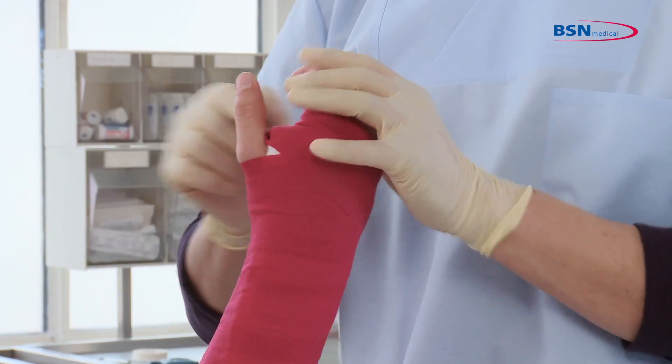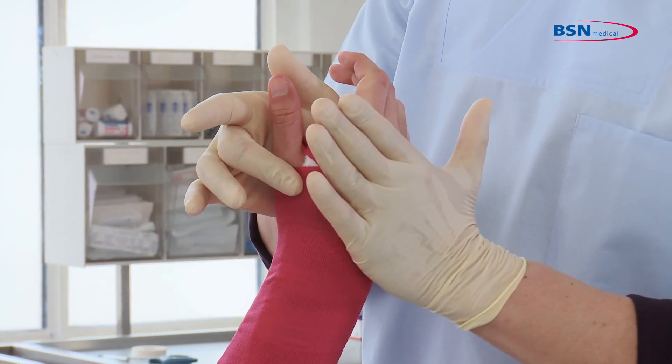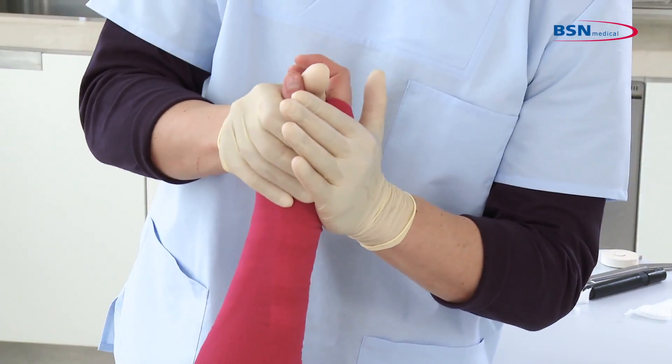Mold with the palm of your hand inside the palm of the patient's hand and hold your other hand against the patient's hand. Position until the splint is in a rigid position. Mold as prescribed by the physician.